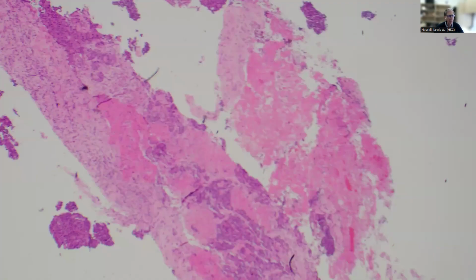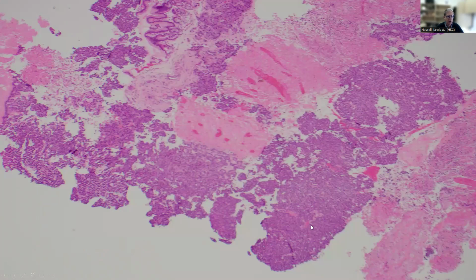So here's a view of the low-power needle biopsy, which is obtained using endoscopic ultrasound. You can see there's a fair bit of necrotic debris and sheets and clusters of cells that appear to be cohesive. As we look a little further, you can see that there's a bit of vasculature to this, but there's broad zones of necrosis, and then this somewhat organoid, fairly uniform population of cells without real good gland formation per se, at least in the macro sense. We have a few colonic glands here nearby.